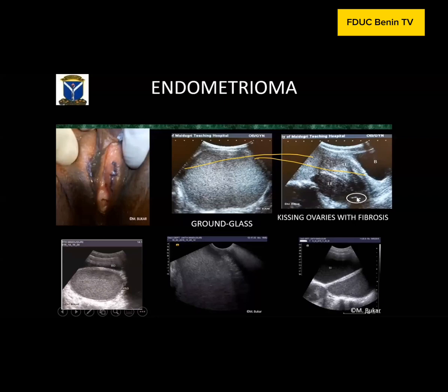If you look at these echogenic areas, they appear to be around the region of the ligaments. Now here you can see an equal to sign, an echogenic sign within the wall of the cyst. So if you see a ground glass appearance and this echogenic wall foci, in all probability you are dealing with an endometrioma. Now if you look at it closely, you realize that the ovary here is actually plastered to the posterior wall of the uterus. And here you can see the right endometrioma is actually adhered to the fundus of the uterus. So this is more like a frozen pelvis.